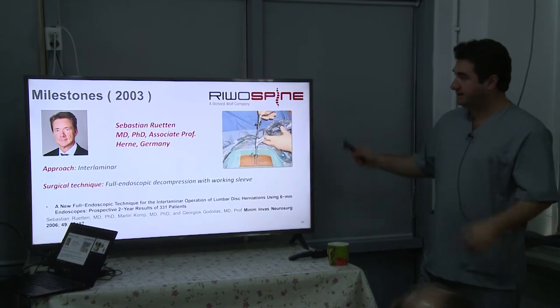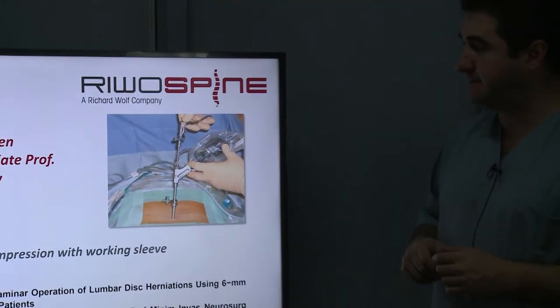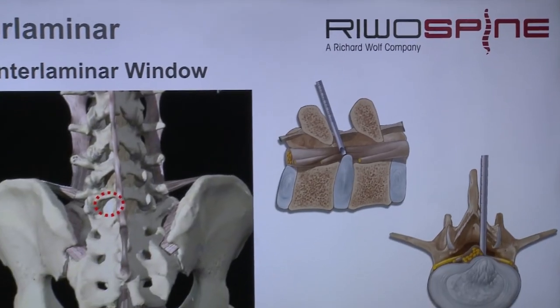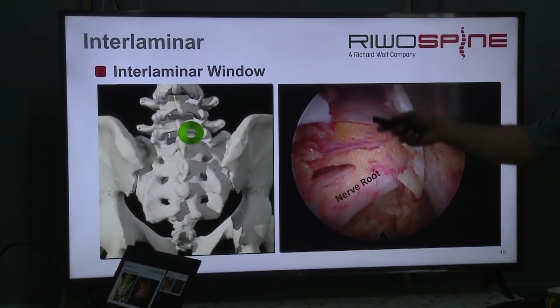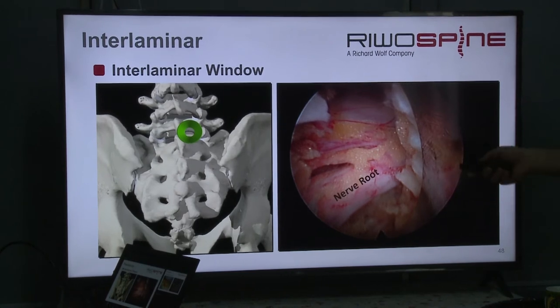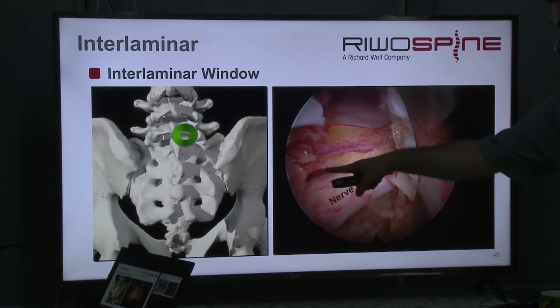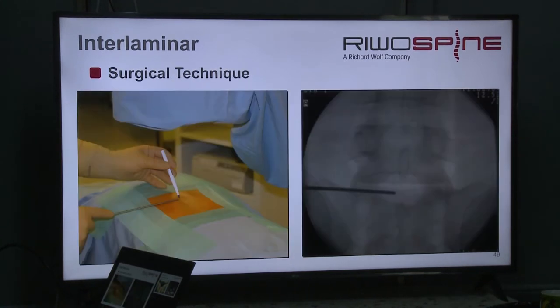Okay, the interlaminar approach was developed by Dr. Rutten from Herne, with whom we are working together. The approach is the same from the posterior. When you open it, I will go too fast here, and then you see the root, cauda equina, axilla, and the shoulder. You've seen it in the case, it's the same.